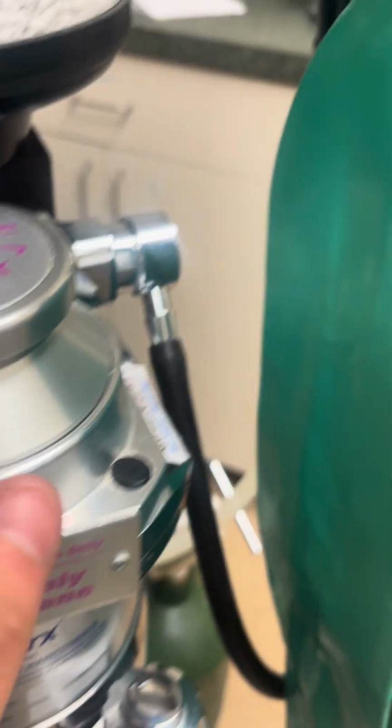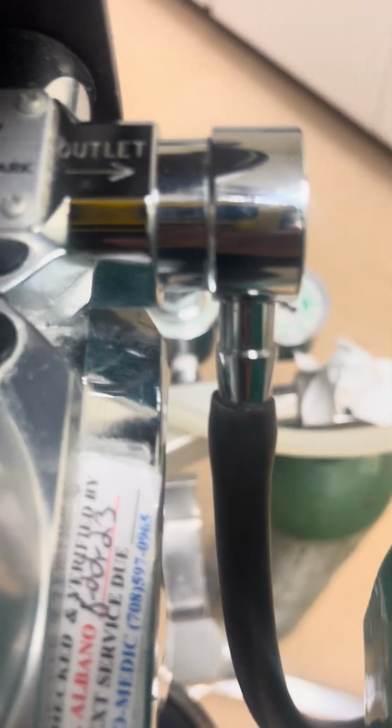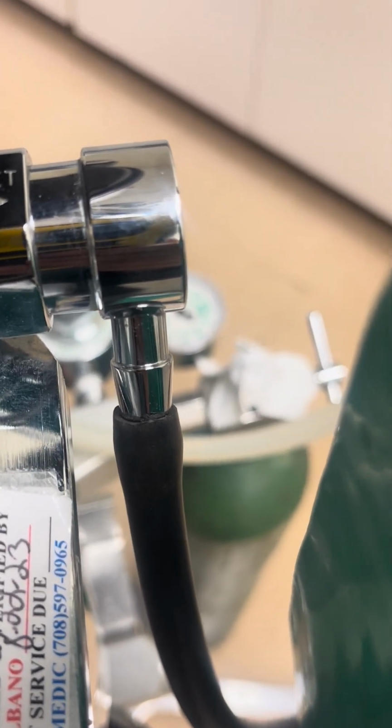And then after the different inhalants that you can use, it comes to the vaporizer outlet, which is this part right here. Then it can go into two different areas, and it's used to vaporize a liquid anesthetic agent and deliver a controlled amount to the patient.